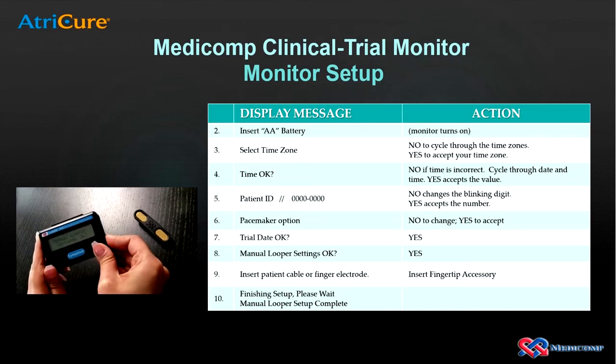The 7th step is quick. Just press yes when the monitor displays trial date OK, as this setting is not used in the monitor for the ATR trial.